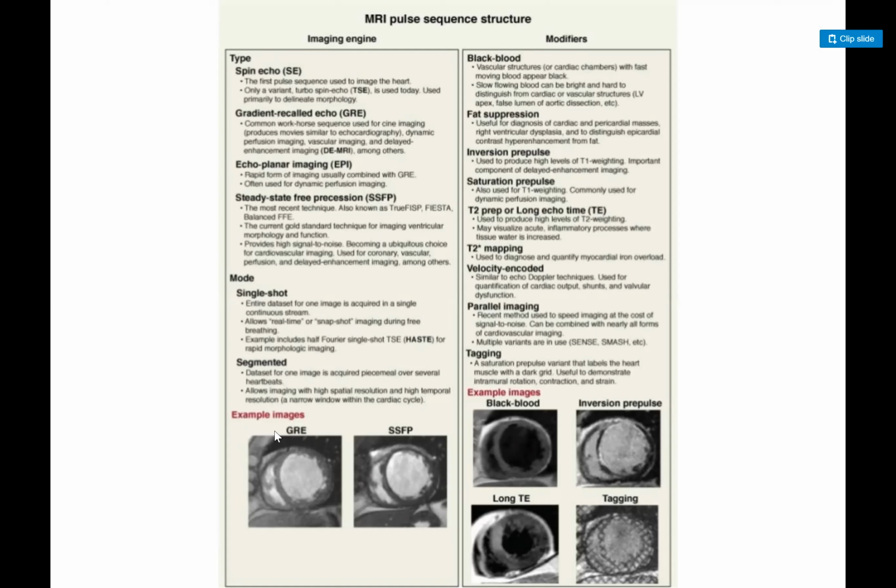However, in certain cases, we might end up using gradient echo because it's quicker if someone is having arrhythmias, or someone has a pacemaker placed. SSFP gets distorted a lot by any artifact. Okay, thank you. So that's the reason.